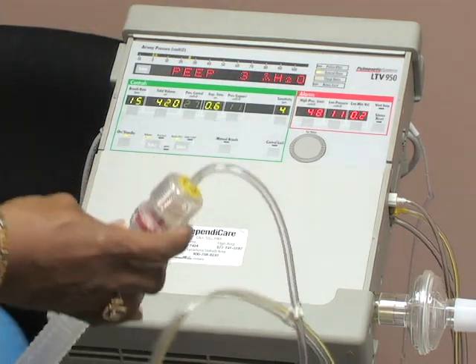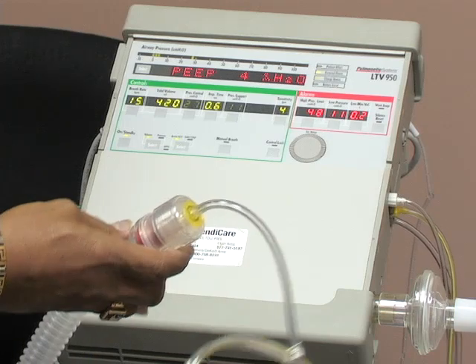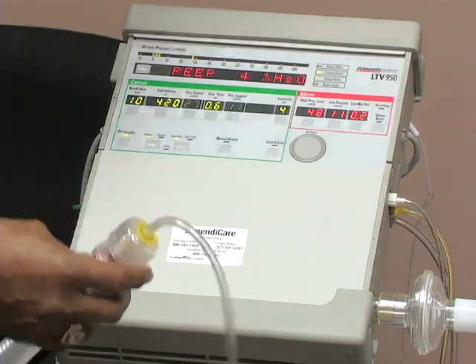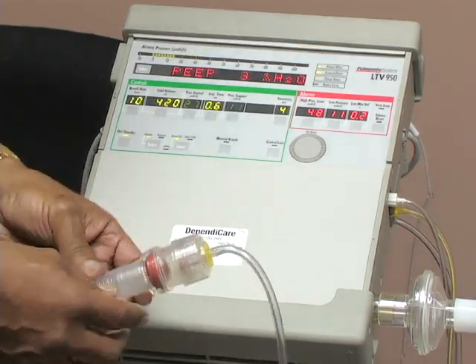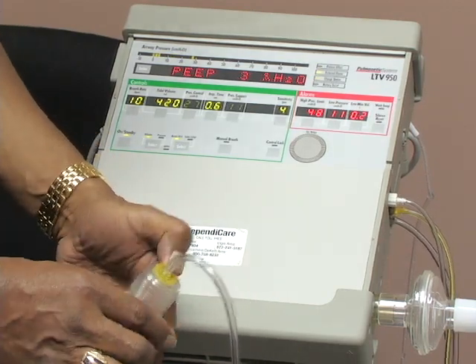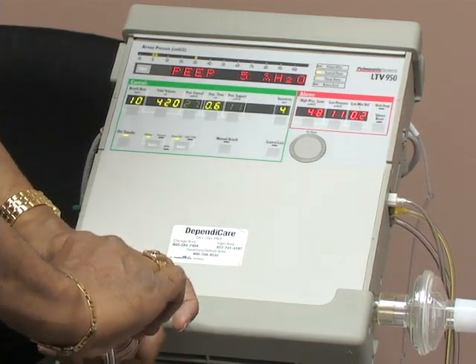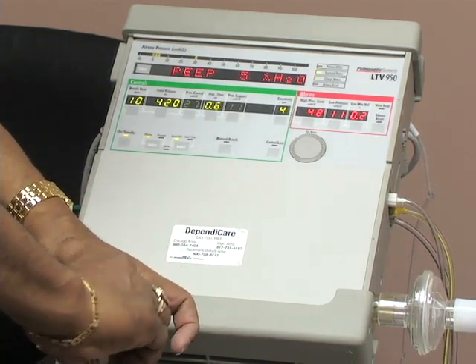Our exhalation valve for the LTV 950 has a PEEP setting on it. The proper way to set your PEEP is through your exhalation valve. You press down on a yellow disc and turn the cap of your exhalation valve clockwise to increase your PEEP.